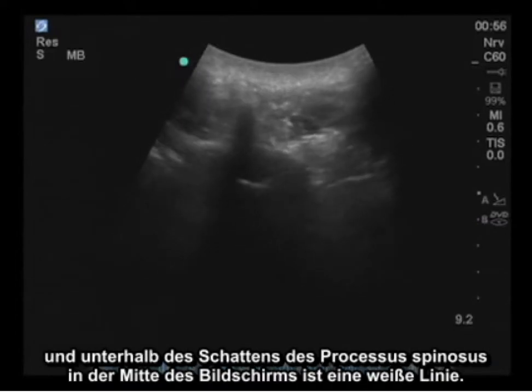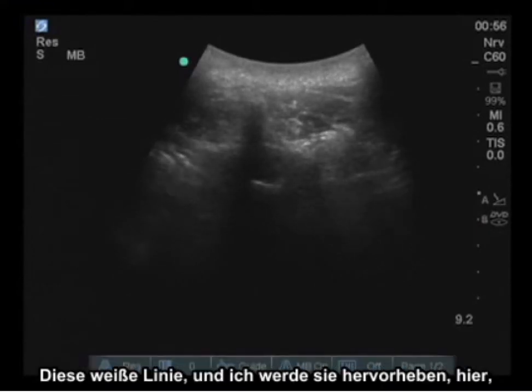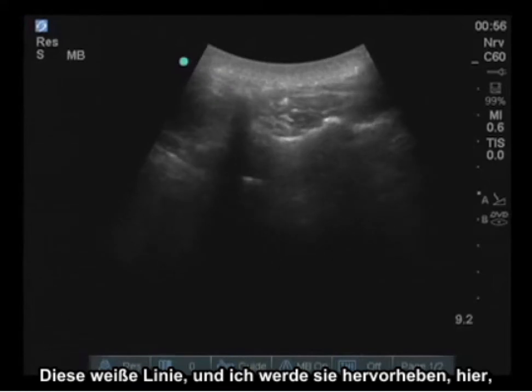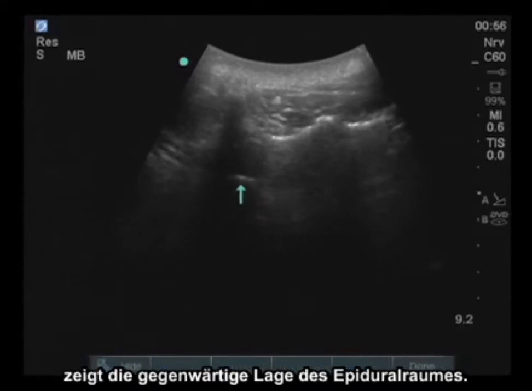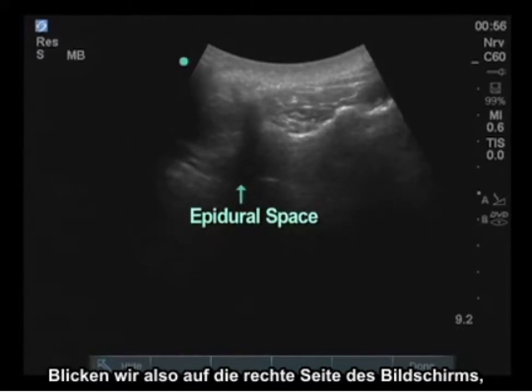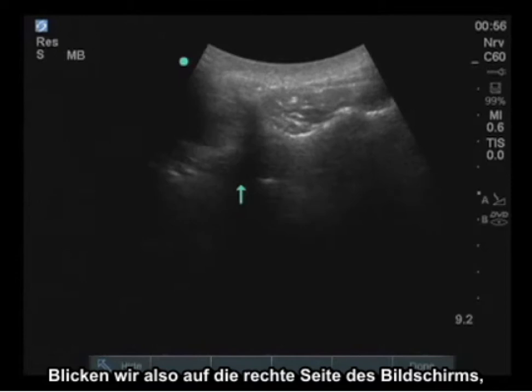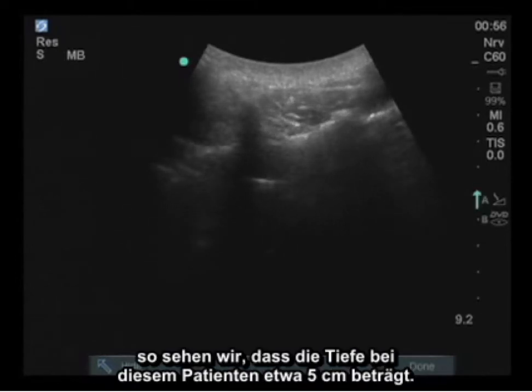In the center of the screen, under the shadow of the spinous process, is a white line. This white line demonstrates the actual location of the epidural space. Looking off to the right of the screen, we can see that the depth is approximately 5 centimeters in this particular patient.